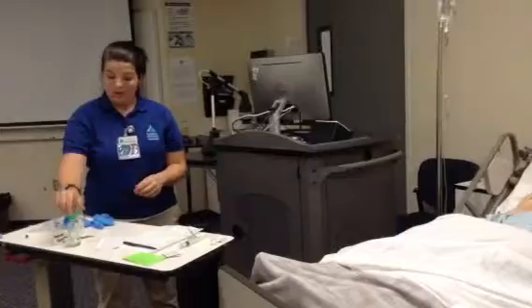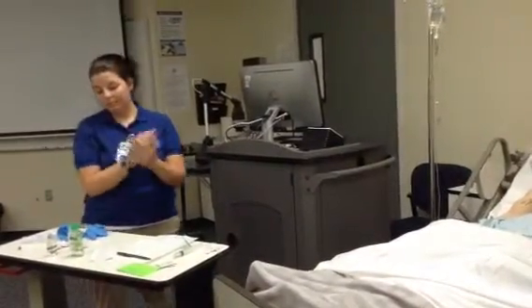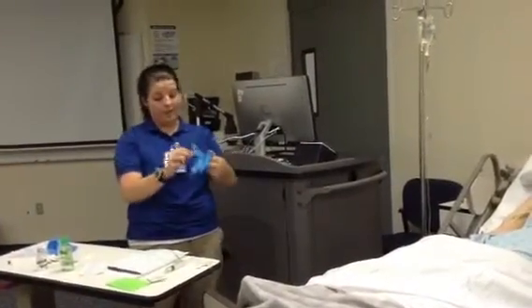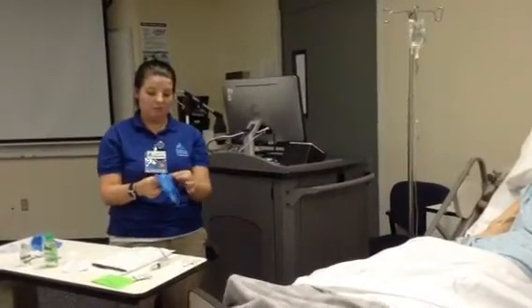Come back in. Hey, how you doing? I'm coming to check on your medication again. Do my hand hygiene. You feeling okay? Alright, good. And it does look like your medication has completely finished dripping. Let me put my gloves on.